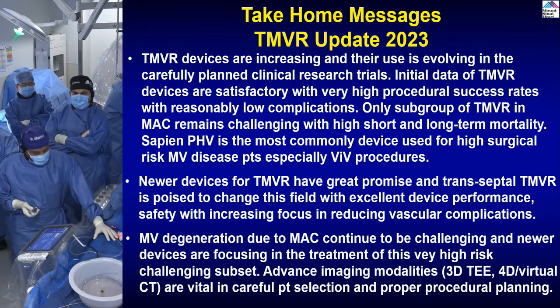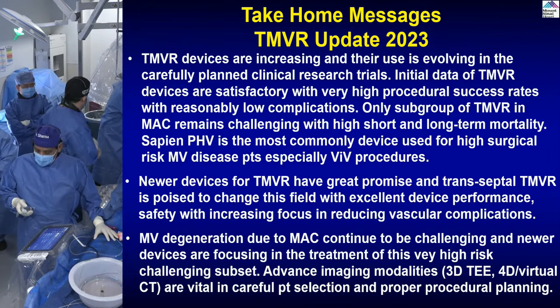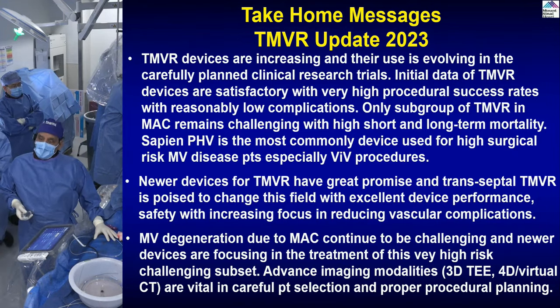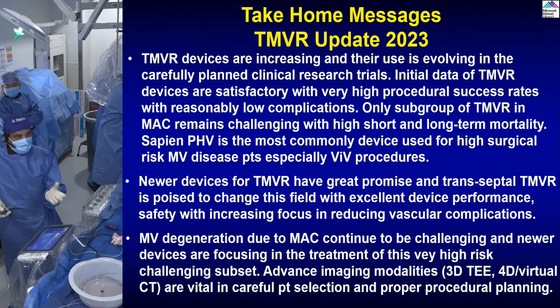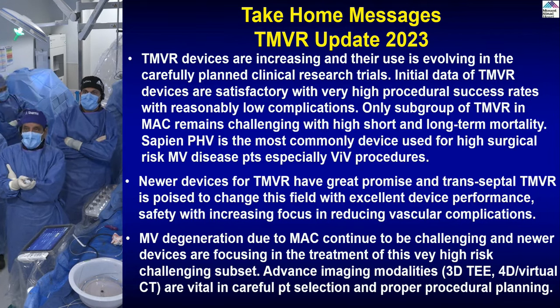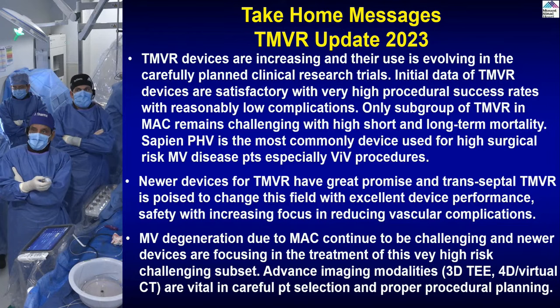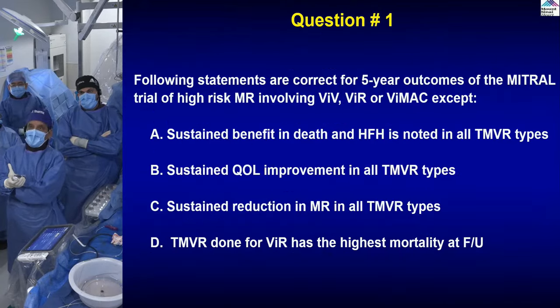Since the Pascal got approval last year, it is now the second player in the market. There are some data from CLASP IID comparing Pascal with the MitraClip, and they did show equal outcomes, except that the time was less, but again, that's part of the learning curve. From an efficacy point of view, both were equal. We always need to diversify our experience by using Pascal in appropriate cases. Is there a difference in when you should use the MitraClip versus Pascal? We still need to understand more, but comparative data are identical in terms of outcome.